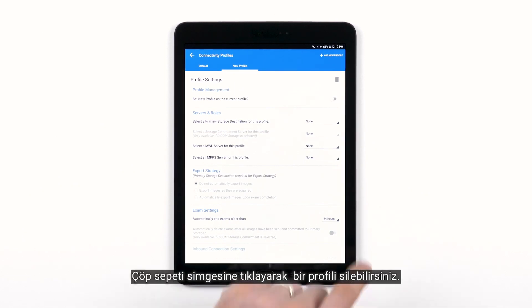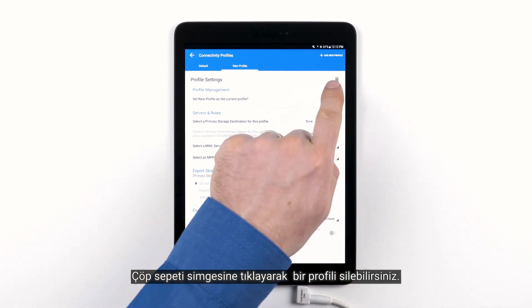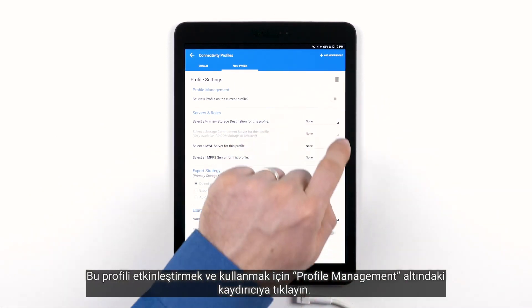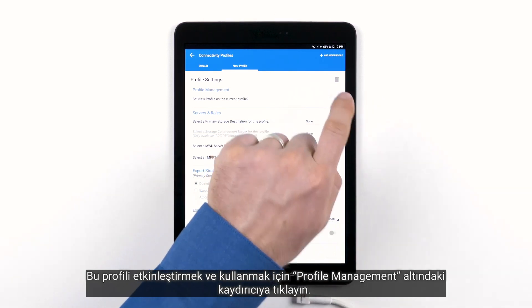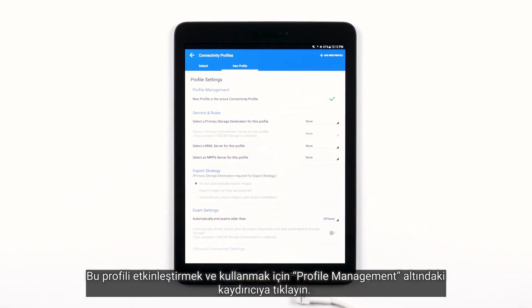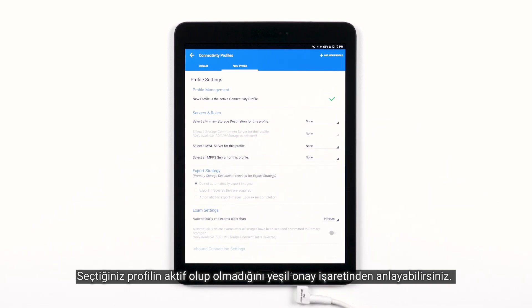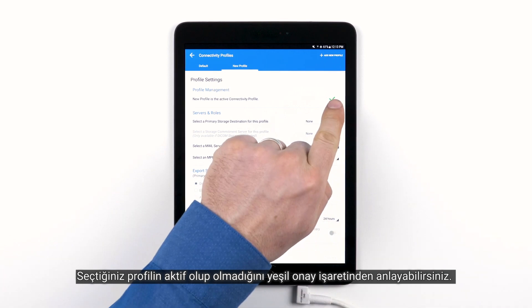You can delete a profile by tapping the trash can icon. To activate and use this profile, tap the slider under Profile Management. Before switching connectivity profiles, you will need to first end an active exam. You'll know if the profile you've chosen is active by the green checkmark.